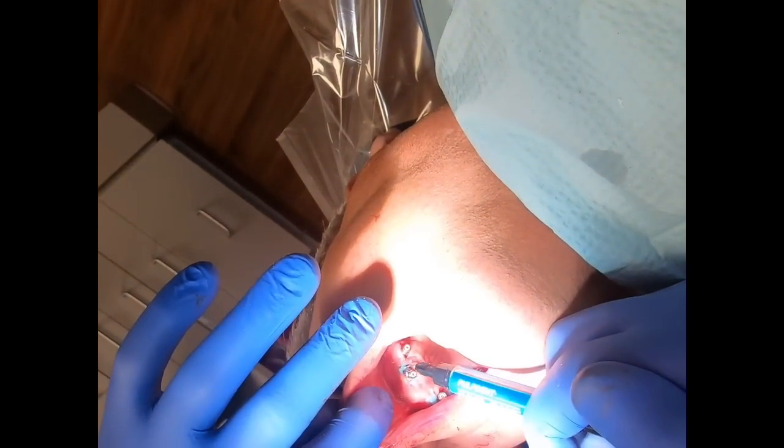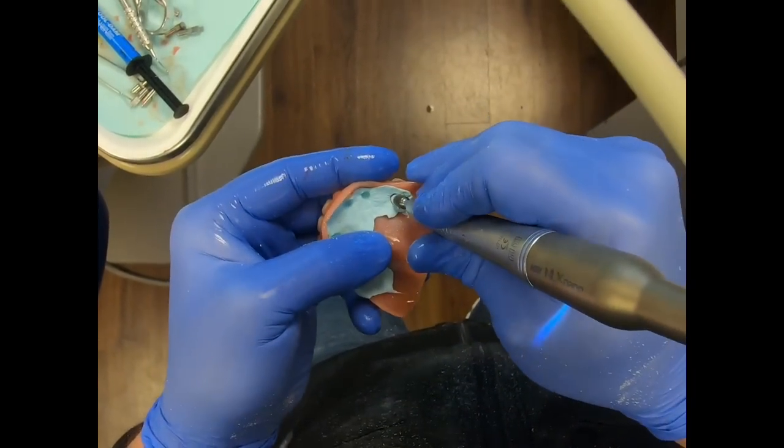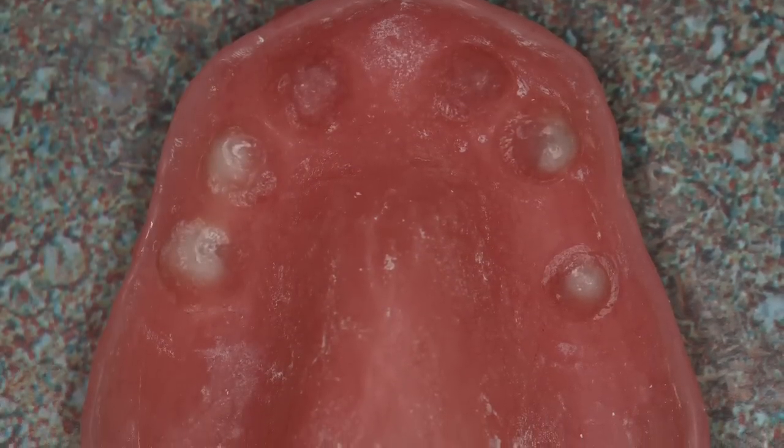So we'll set it to the side and let that material set up. Meanwhile, we'll use some resin and some cool dam to block out the sutures, and then drill into that bite registration material and alleviate the burn through.